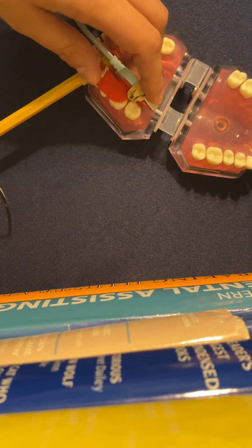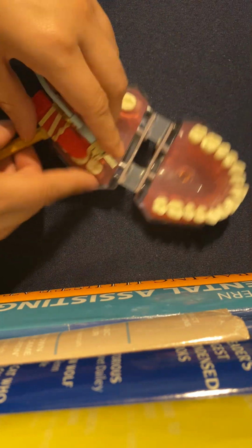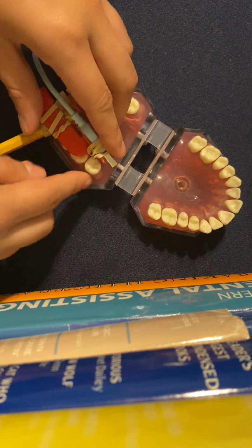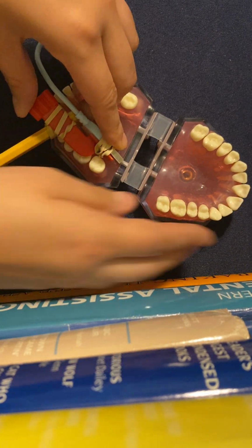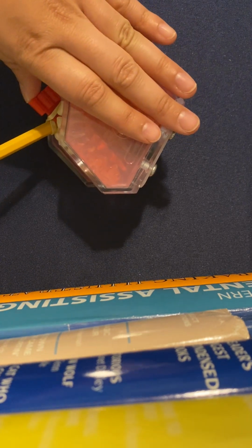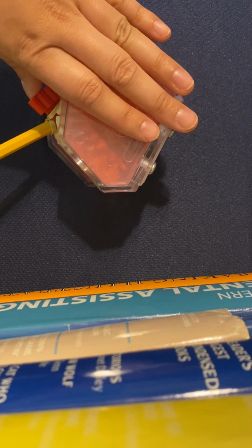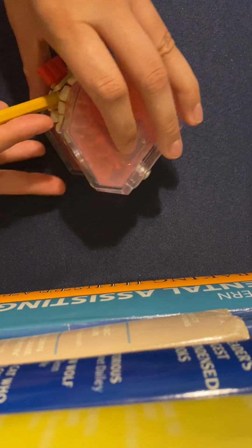So for the molar, place the anterior edge at the middle of the mandibular second premolar. The teeth that you're going to want to see are the maxillary and mandibular molar crowns and the occlusion. And you're going to want to point down from the outer corner of the eye to the occlusal plane.